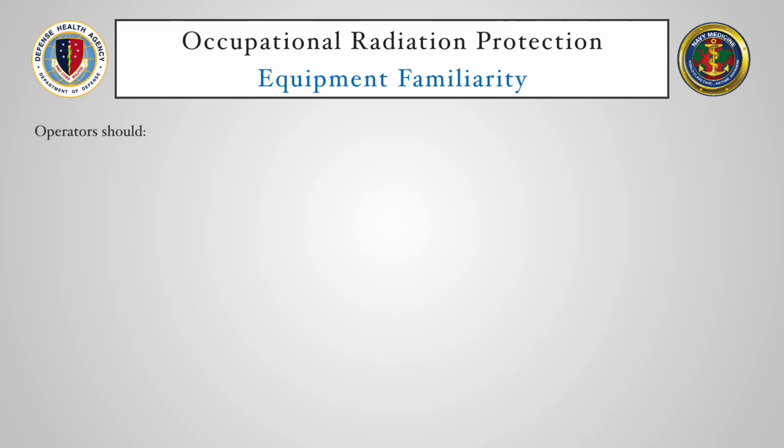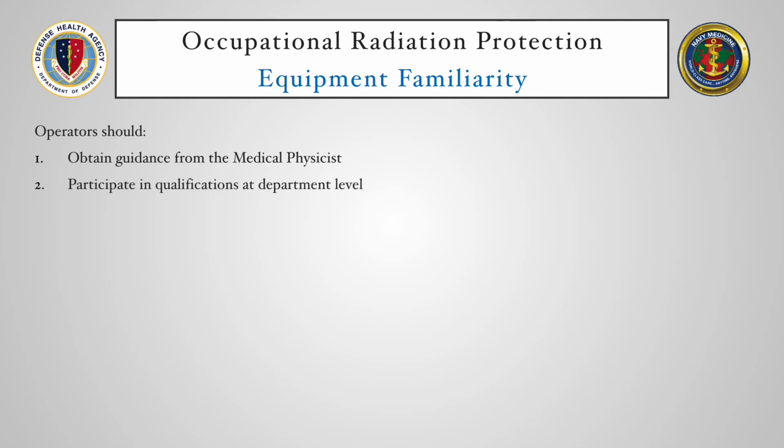Operators should do a few things to become familiar with the equipment. Obtain guidance from the medical physicist that's in charge of surveying the equipment. Participate in qualifications at the departmental level to document that they're familiar with the equipment. Participate in routine applications training that is available for purchase from the manufacturer and can be facilitated by your department head. And research and review technical manuals.